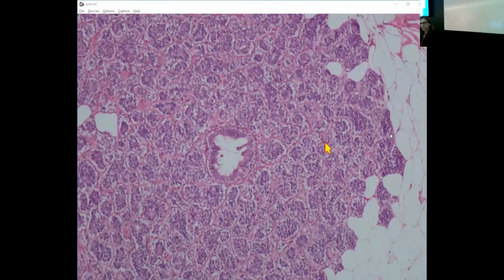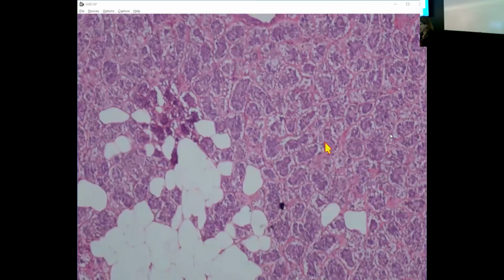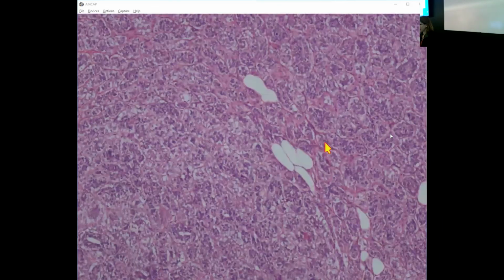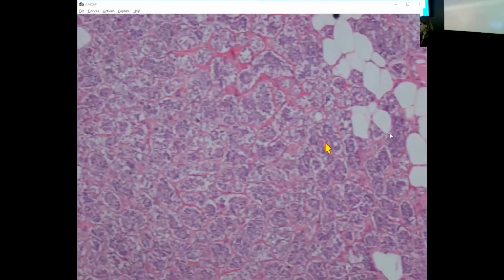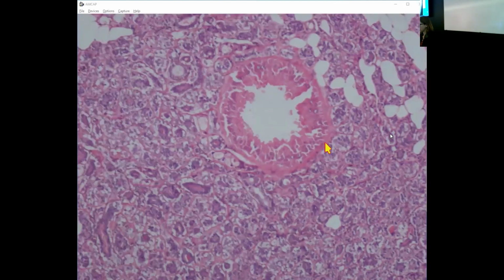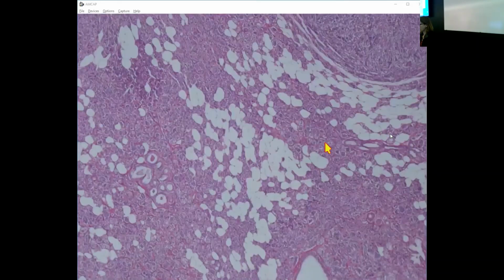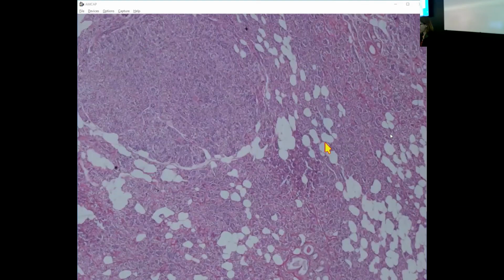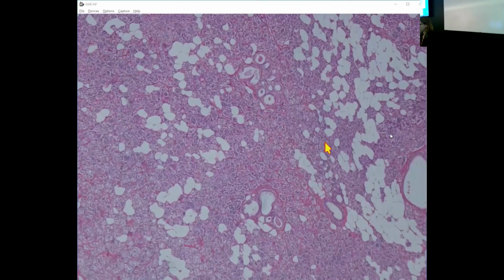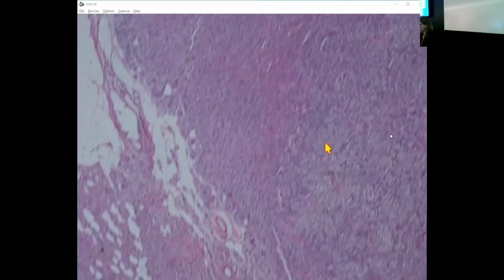Sorry? Yeah. So it recalls for me epithelial myoepithelial carcinoma. Yeah, so that could be a consideration, surely. Right. But what we ended up considering this as was part of an atypical adenomyoepithelioma. There was an area of a more lobulated mass. And there's something like a tubular variant of adenomyoepithelioma where you have all these tubules that have both epithelial and myoepithelial cells. And honestly, it can be quite alarming because it can look quite infiltrative through the stroma.